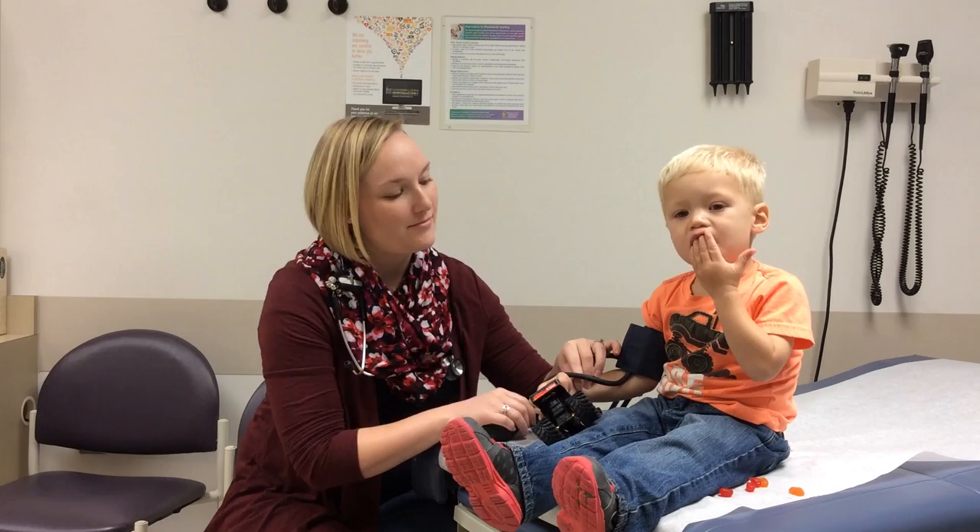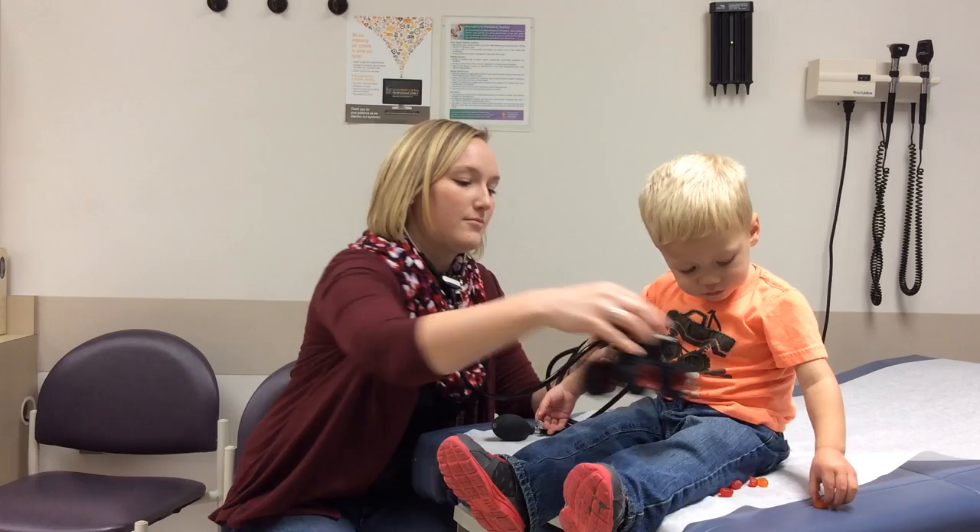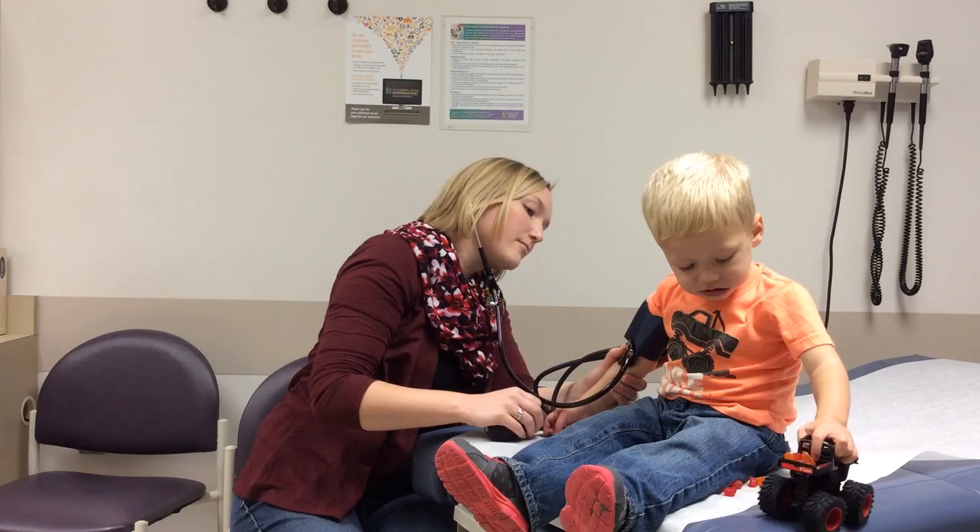Next, obtain the obliterative pulse pressure value. Inflate the cuff slowly while palpating the radial artery. When the radial artery is no longer palpated, this is the estimated systolic blood pressure. When proceeding with the blood pressure measurement, inflate the cuff 20 to 30 millimeters of mercury above the observed obliterative pressure.